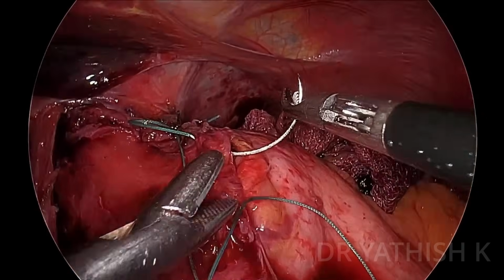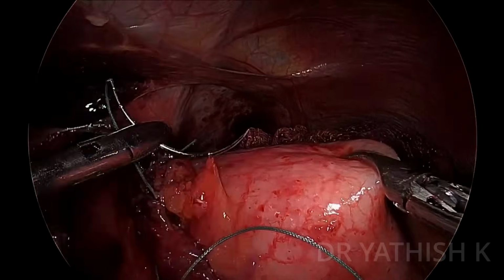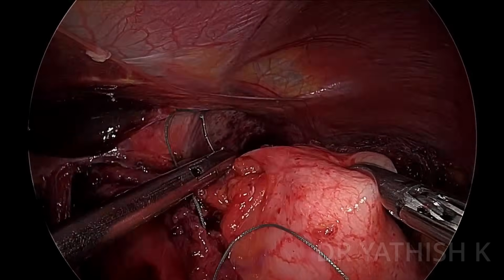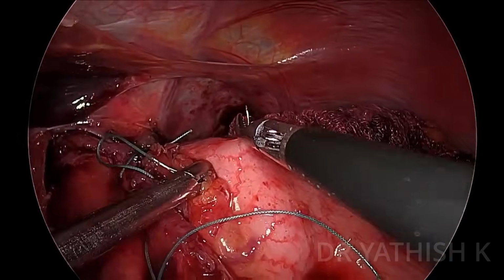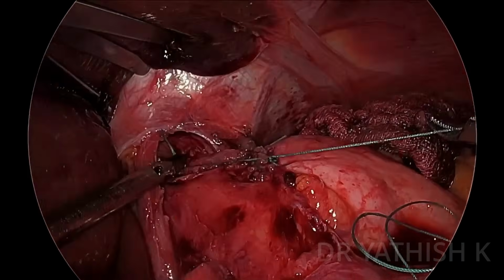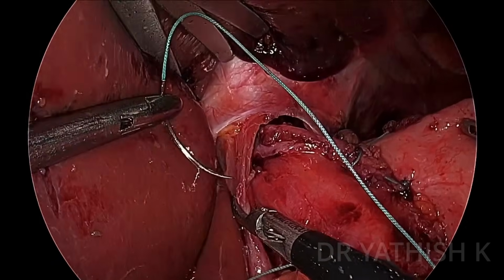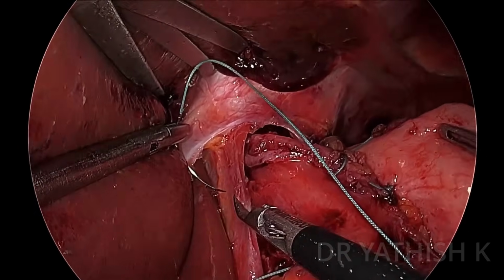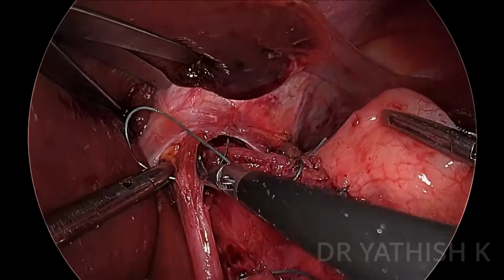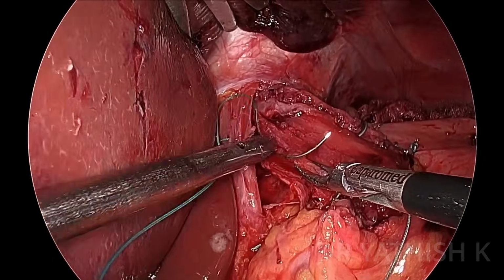So I'm taking another bite again on the musculature. This time I'm not going to use the hiatus here. I'm just taking the musculature and the anterior surface of the fundus. So I'm using a 2-0 Ethibond suture. Again, there are few people who use Ethilon and few people who use Prolene. So now the same steps are followed on the right side.